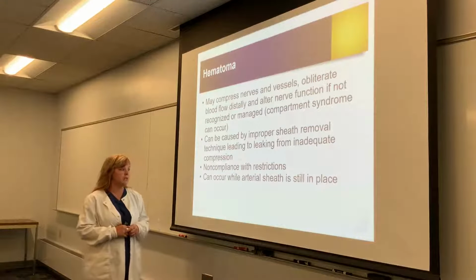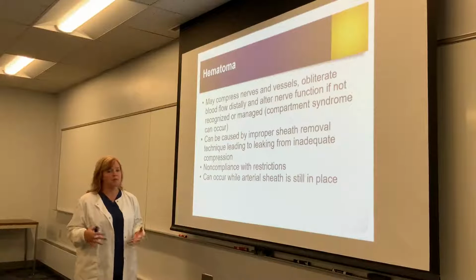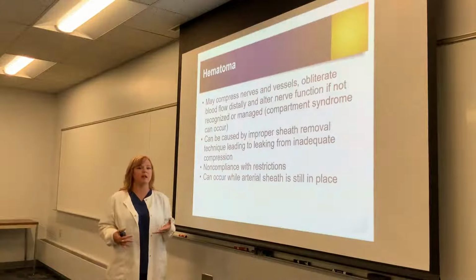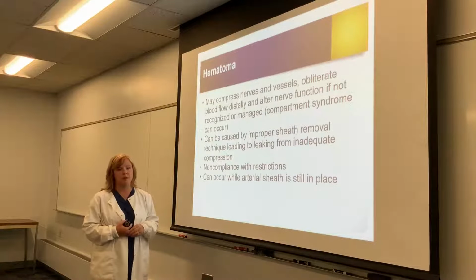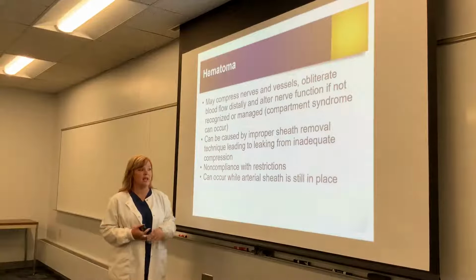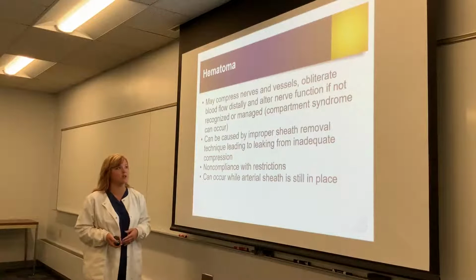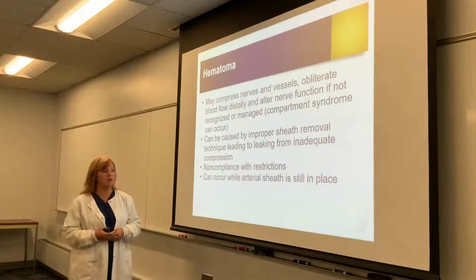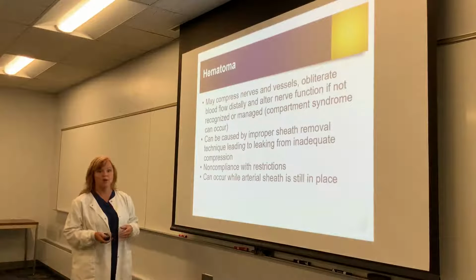So you can see them, a lot of times fidgety patients, forgetful patients, patients with back pain who just have a hard time laying flat and are moving more, you can see an increased risk for hematomas developing. And just to mention, they can occur while the sheath is still in place. That's going to be less common, but that can still occur. So if your patient comes back from procedure and has the sheath in for an extended period of time, you're still monitoring the site very frequently, usually every 15 minutes until that sheath is out.